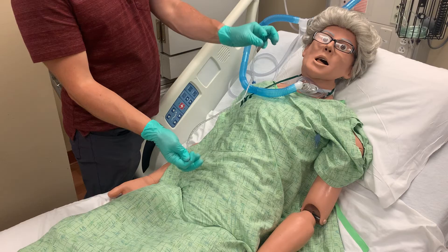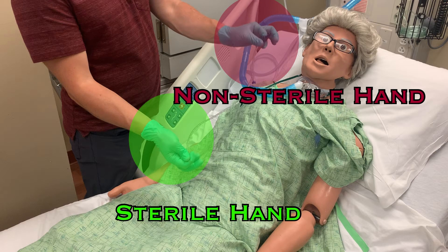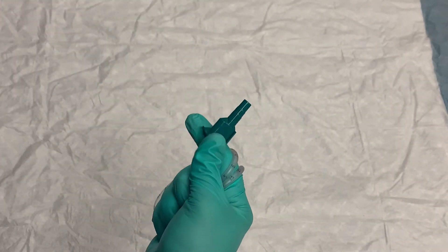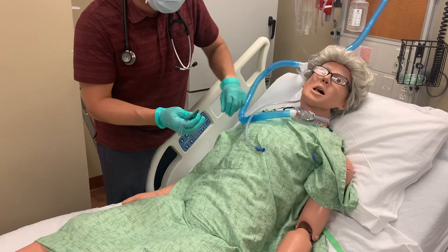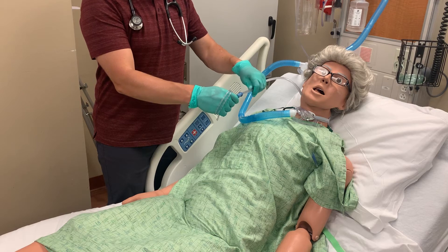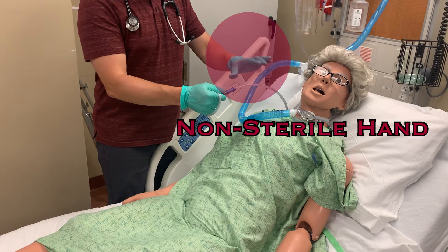Hold the green adapter end with your non-dominant hand and hold the opposite end with your dominant hand. During the suction procedure, your dominant hand will remain sterile while your non-dominant hand will become your non-sterile hand. Coil the catheter around your dominant hand — this allows you to control the tubing and adapter with your sterile hand while your non-sterile hand attaches the suction tubing. Using your non-dominant hand, connect the suction tubing to the adapter end of the suction catheter by pushing the Christmas tree end into the tubing. From this point on, that non-dominant hand is no longer sterile and should not touch the trach or the suction catheter for the remainder of the procedure.